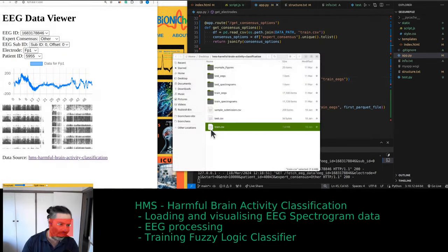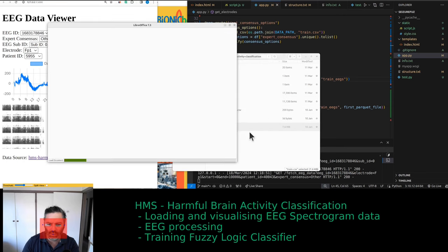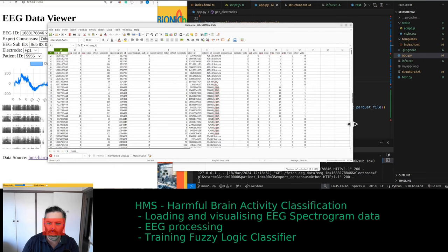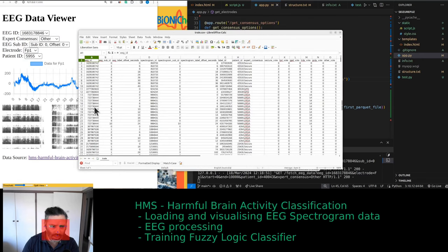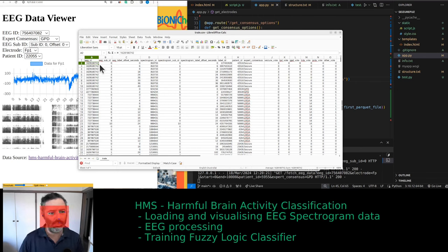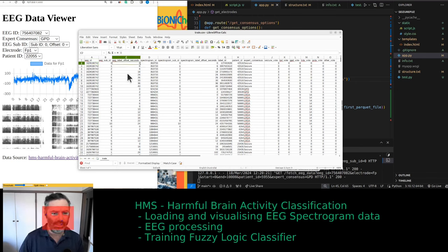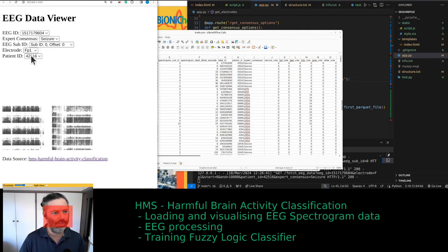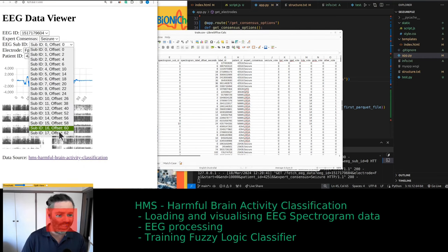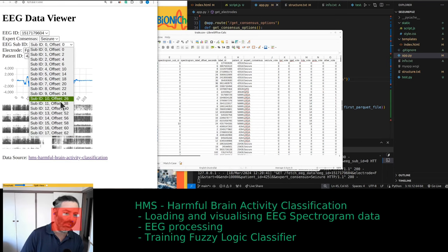There are a bunch of labels in this data — specifically those with different types of abnormal EEG activity. The important file is the train CSV. You can open it and see: there is an EEG ID with multiple copies of it, and there is an offset in seconds. The original one we load by default has these 18 labels.